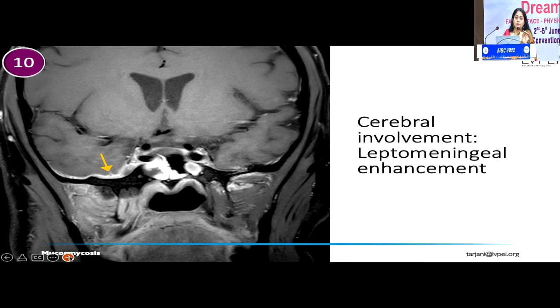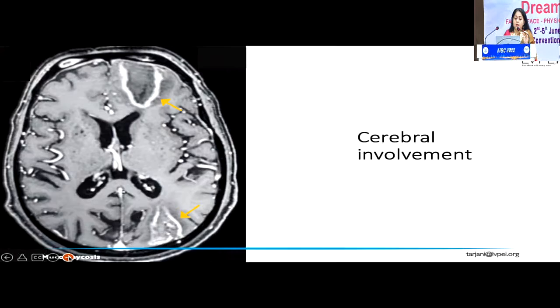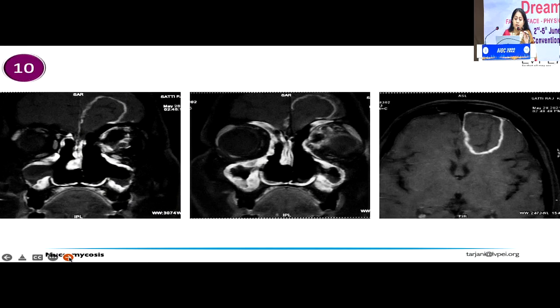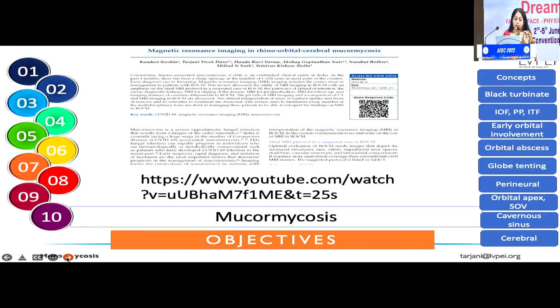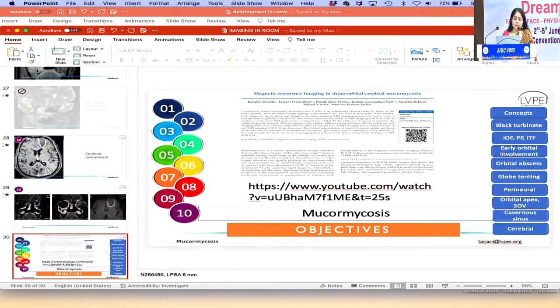For cerebral involvement, early involvement is seen as leptomeningeal enhancement. Then slowly progressive involvement includes formation of an abscess — again the same concept: hyperintense outside, iso to hypointense inside, suggesting an abscess in the brain. Another patient shows a similar abscess in the frontal lobe. This is some resource material you can go through if you're interested in studying imaging in mucormycosis in greater depth.